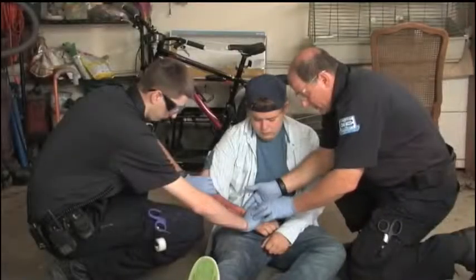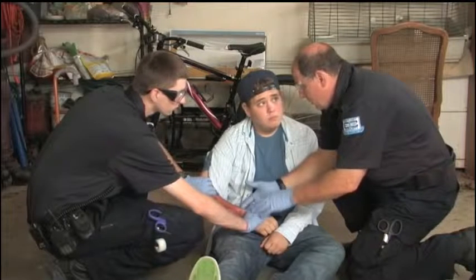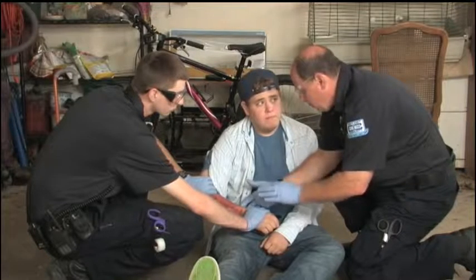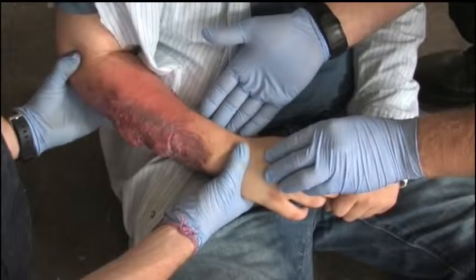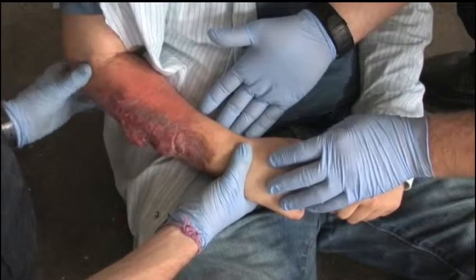Utilize a second rescuer to hold manual stabilization of the bones above and below the injury site. Assess the patient's distal pulses, motor function, and sensation, or PMS, in the extremity prior to immobilization. A lack of distal circulation is an indication that you should attempt to realign the extremity.